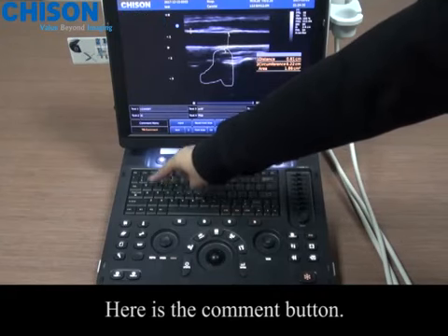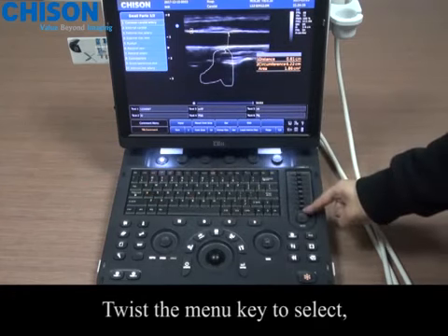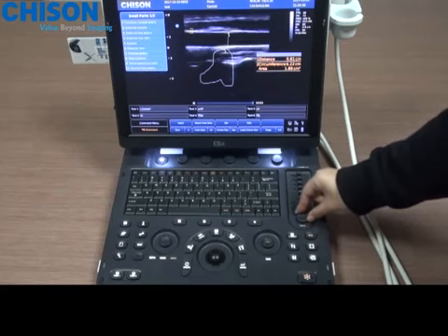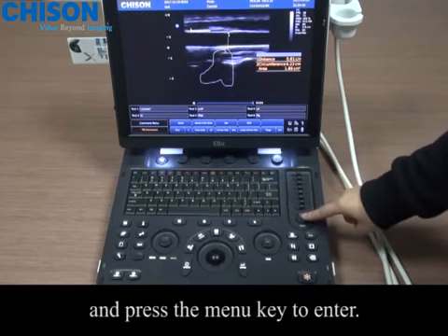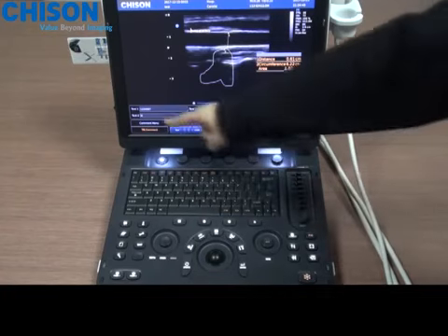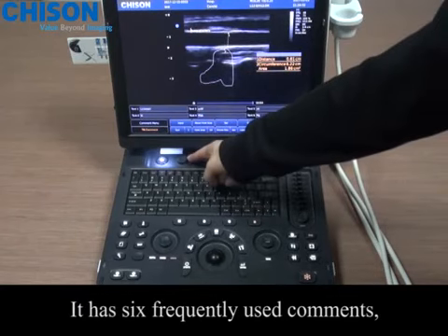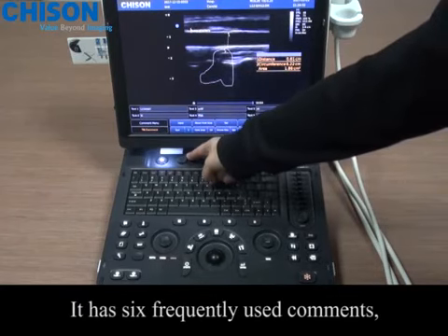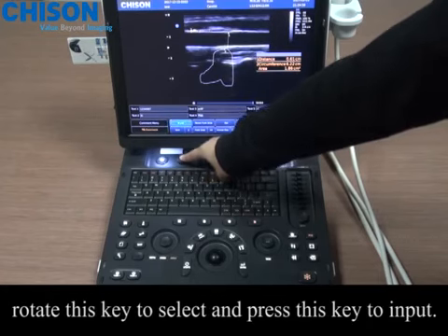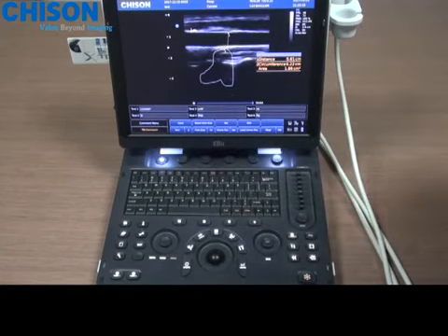Here is the comment button. Twist the menu key to select and press the menu key to enter. We also have the quick comment, which has six frequently used comments. Rotate this key to select and press this key to input.